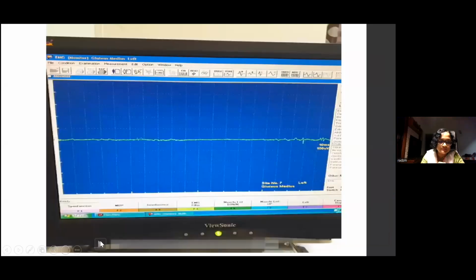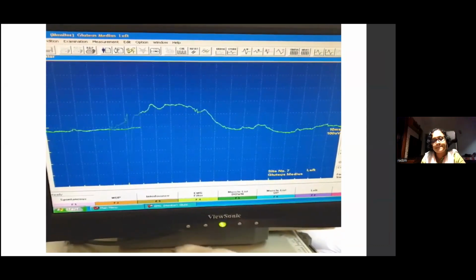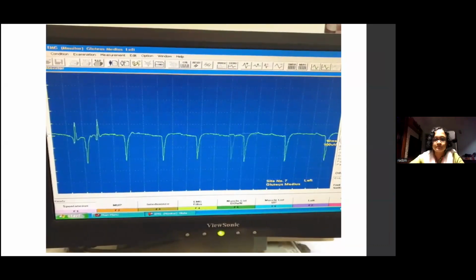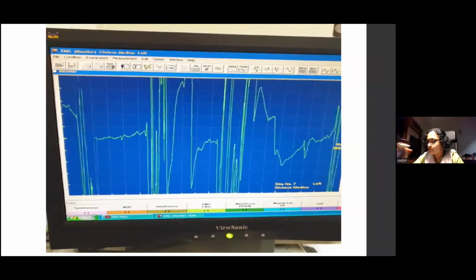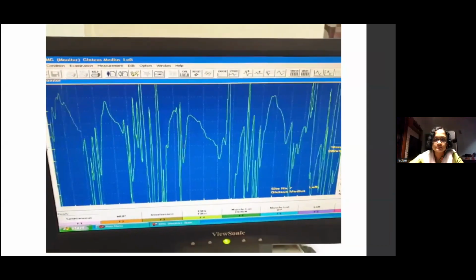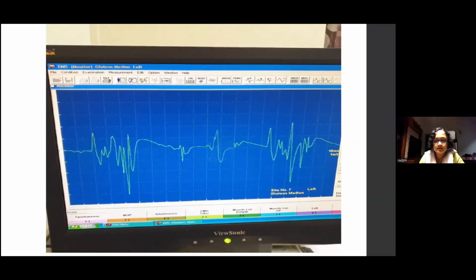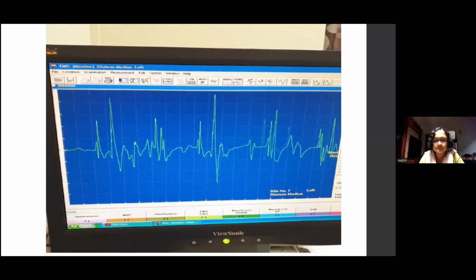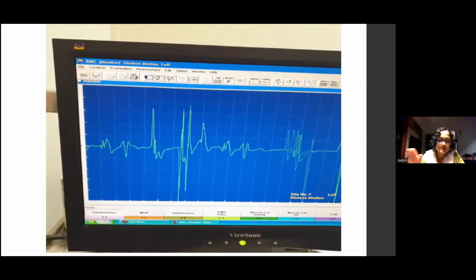Just listen to this one as well. So it's fibrillations, positive sharp waves. So CRD, that's a complex repetitive discharge. Activated muscle. So the kata sound, that's reduced recruitment. That's the kind of sound that you'll get used to as you go along. And that's really helpful if you can use that to differentiate.